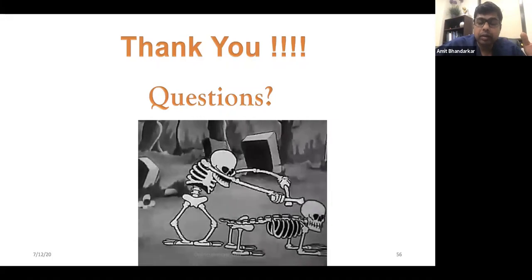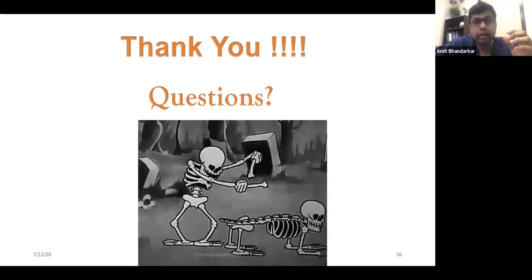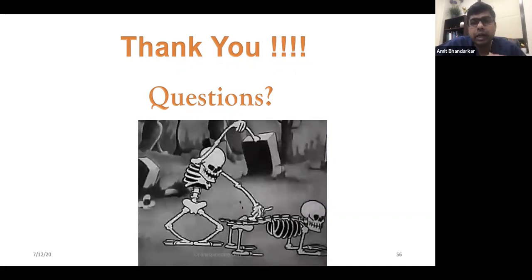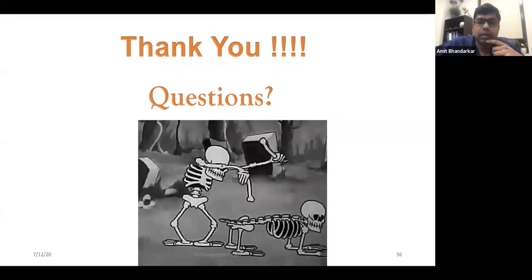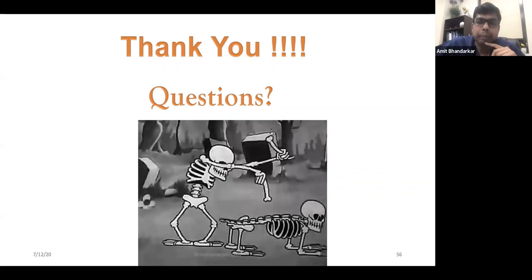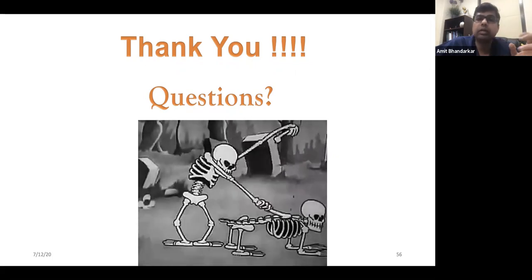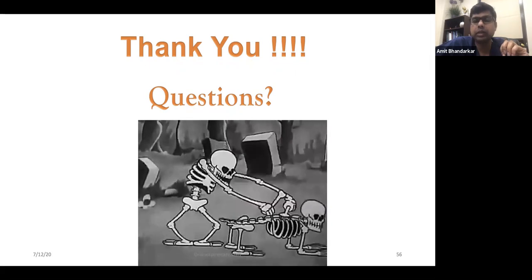For example, I think the cage and all those things come into play when, say, a patient has a lot of flat back, or loss of lordosis at that area, and has a lot of pelvic tilt to maintain sagittal balance at that particular point of time. I have seen that the moment we restore lordosis by inserting this cage and taking efforts to restore lordosis at that area, the long-term pain relief and the outcome definitely change. The patient's pelvic tilt changes, his effort to stand and walk around changes. So looking at it from a pain surgeon's perspective has helped me quite a bit in solving that problem.